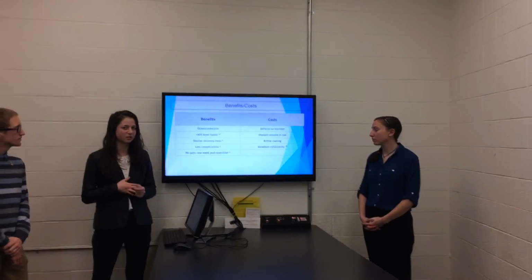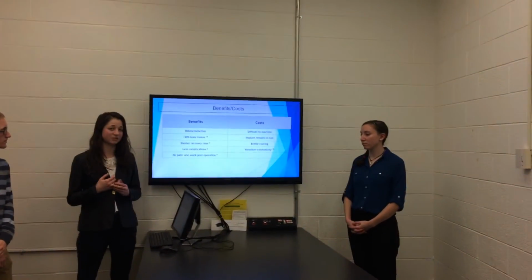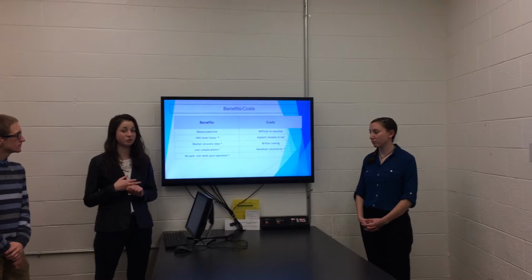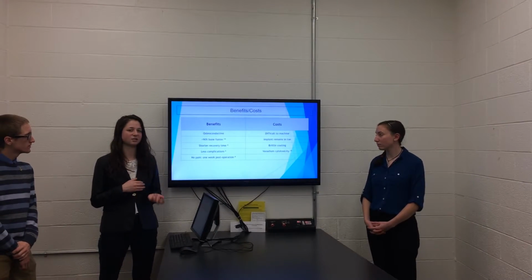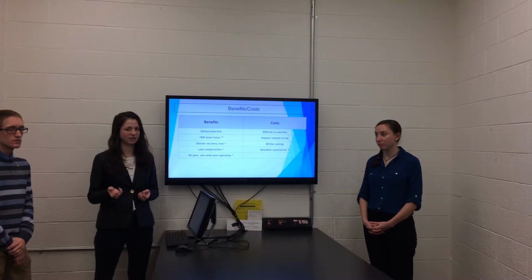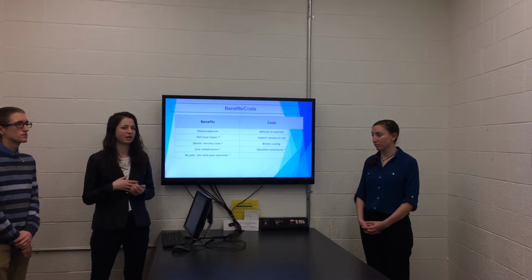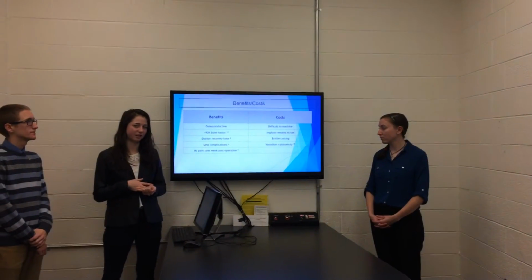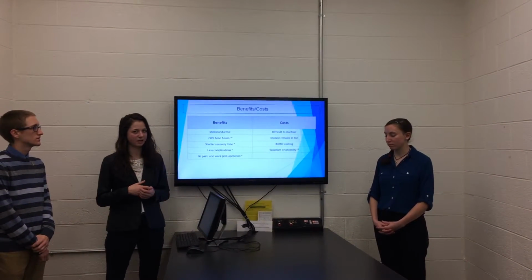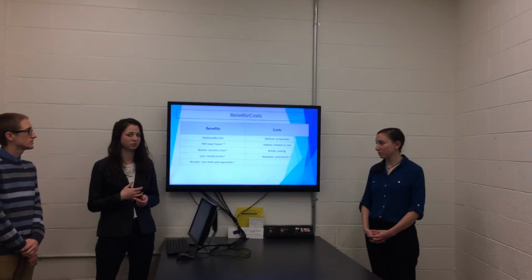There are some costs to our implant because it's made of titanium and has a lot of small ridges and protrusions. It will be difficult to machine. The implant does remain in the toe for the entire lifetime of the patient, so it can have some unpredictable consequences, such as the vanadium in the alloy could release cytotoxic ions, and the coating is brittle, so breakage is a concern.